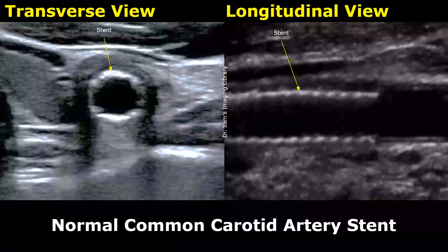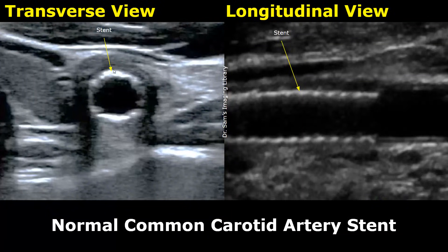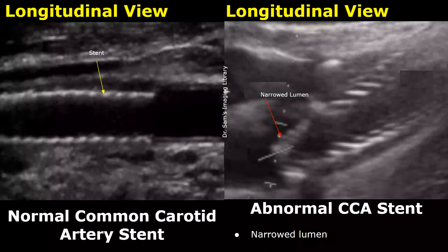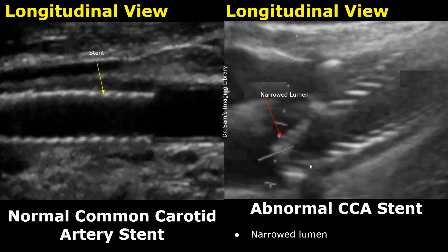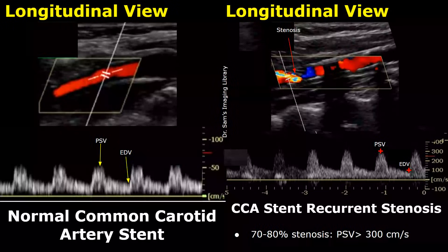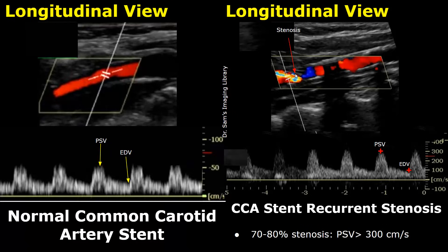Here are images of common carotid artery stents in transverse view and longitudinal view. The stent appears as a mesh-like structure lining the lumen of the carotid artery. In this image, we can see an abnormal stent with narrowing of the lumen — some stents can cause stenosis of the artery after a period of time. On spectral Doppler, if the PSV at the site of stenosis is more than 300 cm per second, it is considered a 70 to 80% stenosis. In this case, the PSV has crossed 300 cm per second, indicating a stenosis of 70 to 80%.